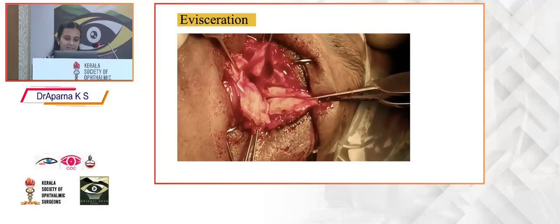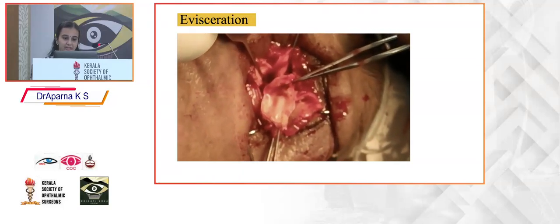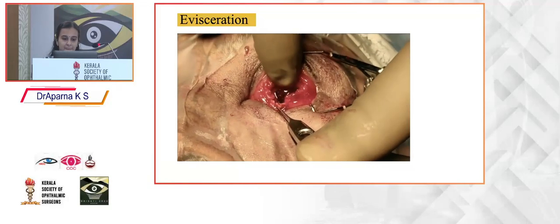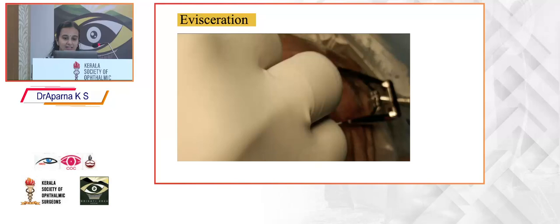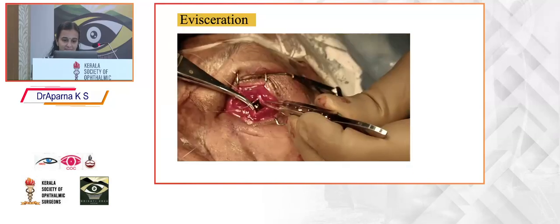So these are the 4 petals, with anterior and posterior ends free. This allows placement of a larger implant, so that I could place a 20 mm PMMA implant easily. Next is the closure of the sclera: opposite scleral petals are closed with 6-0 Vicryl interrupted sutures in a double breasting manner.